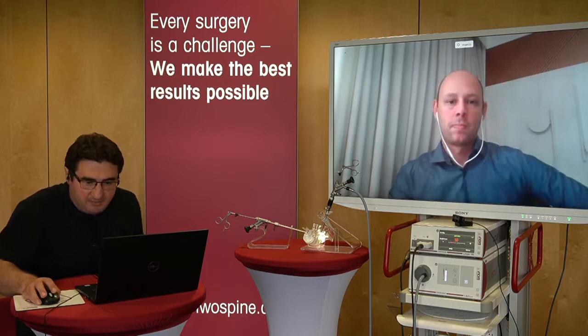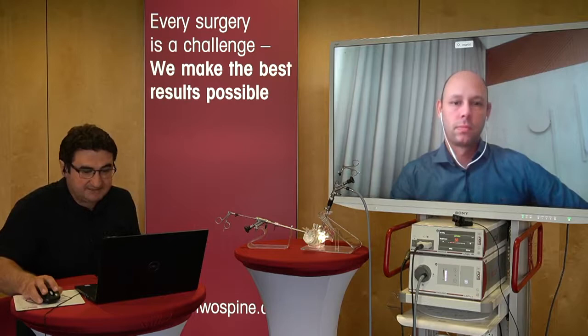Do you think that every patient with cervical disc hernia and cervical radiculopathy could be done endoscopically? Can you choose it for every case, every cervical herniation? Yeah, that's a good question. I talk about this in the presentation, but we prefer the posterior approach only for the lateral or foramen pathologies. I do my surgery for disc herniation in the lateral recess, disc herniation in the foramen, and foramen stenosis, only for this.